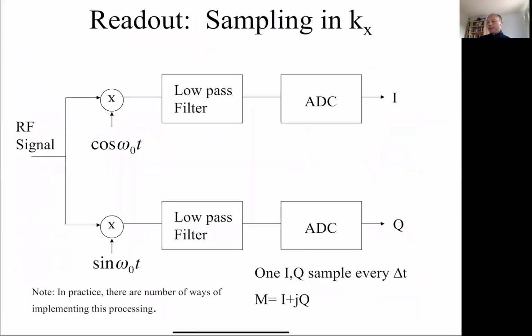Okay, so we're going to talk a little bit about how to actually practically design a spin warp pulse sequence. Just to preface what's going on here, this is going to be a specific application of the design equations that I gave you for delta Kx and delta Ky and Wkx, Wky. We're going to do that specifically for the spin warp pulse sequence.